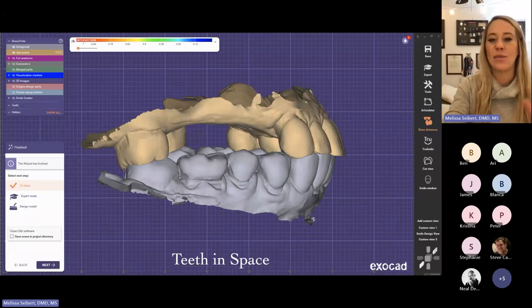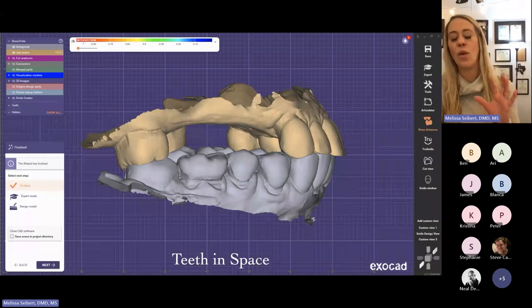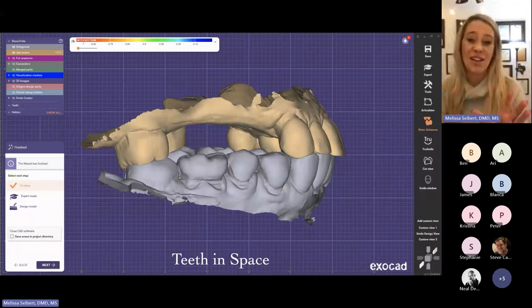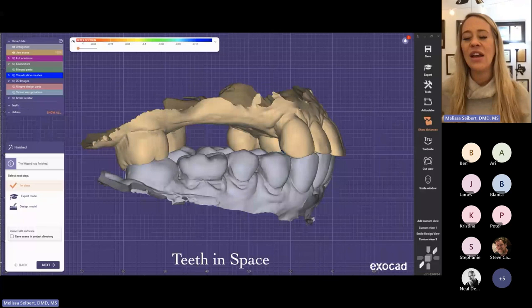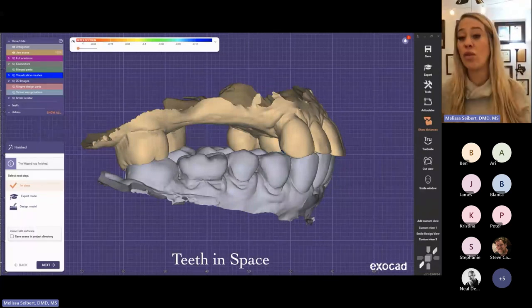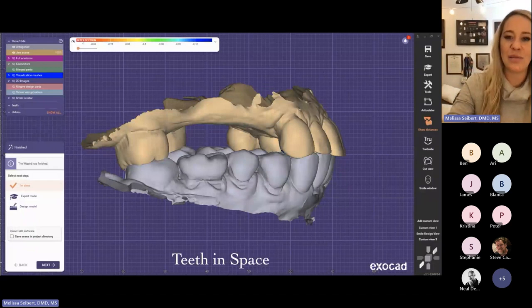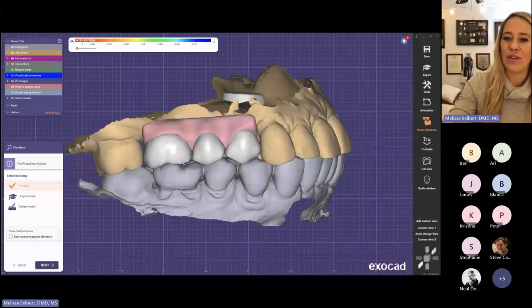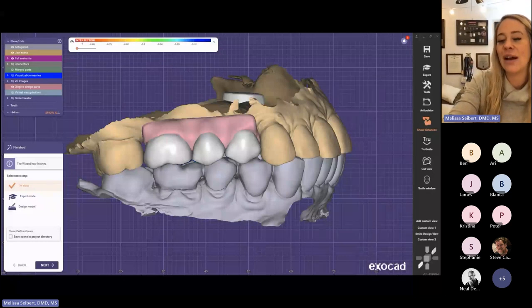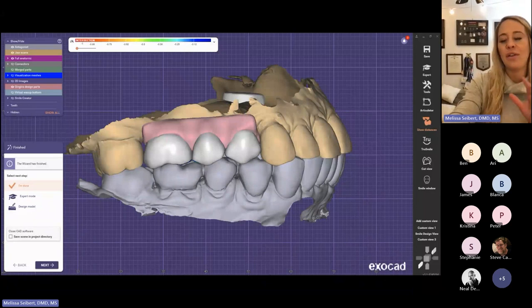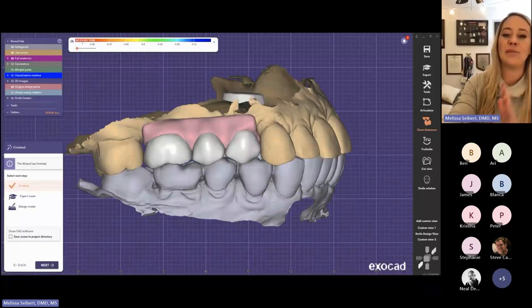Here's an example of a case where I used the ExoCAD DentalCAD application to adjust the occlusal plane, add back hard and soft tissue, so everything could go where it ideally needed to be. In this mandibular arch, there's been some corruption of the occlusal plane — a bit of a reverse curve of Spee. Old me would have just positioned the teeth to get idealized contact, but I would just be replicating that reverse curve on the maxillary arch, which could lead to problems. She also has a very big smile with buccal corridors. So what I did was use the facial plane pull feature to level her mandibular occlusal plane, position the maxillary pontics into place, and add back some pink gingiva where grafting wasn't feasible. This helped me plan what we ultimately did: an implant-retained FPD.